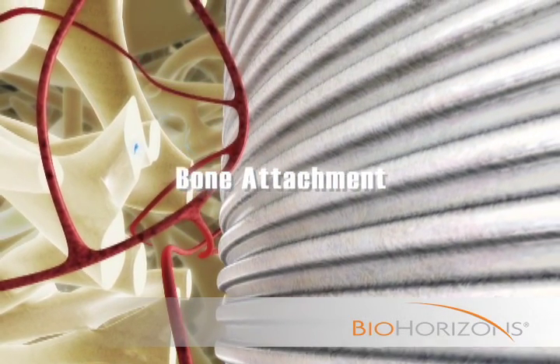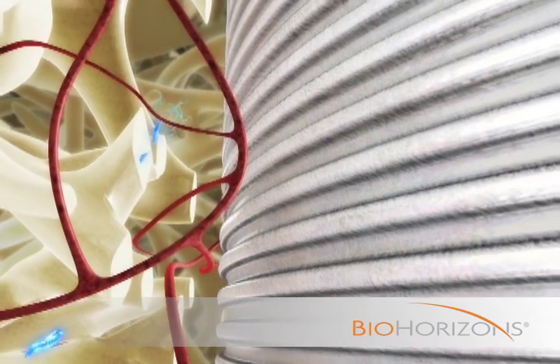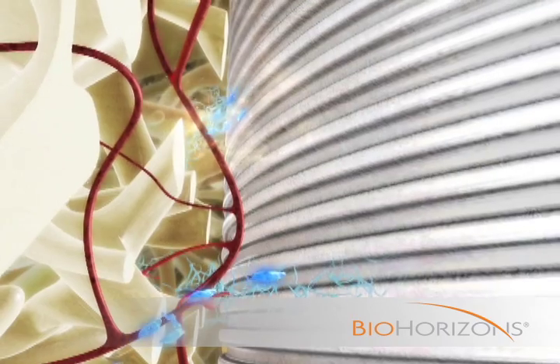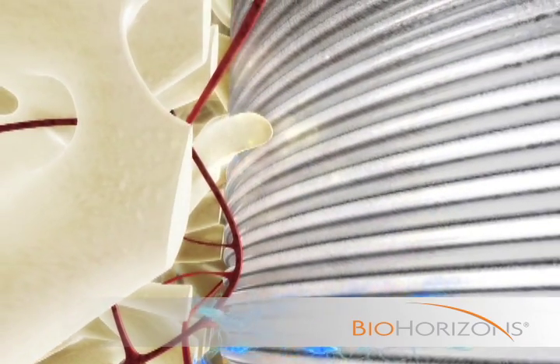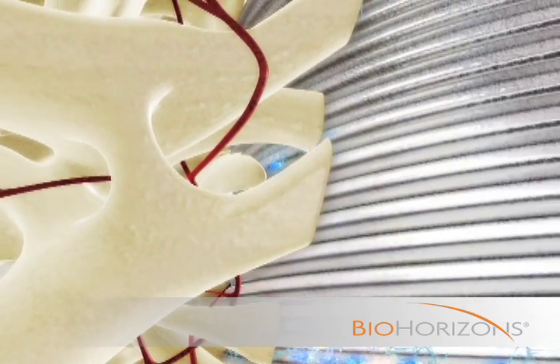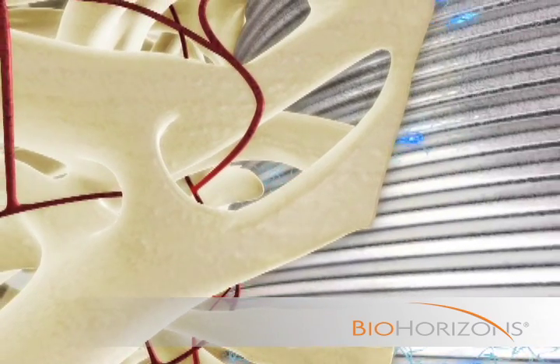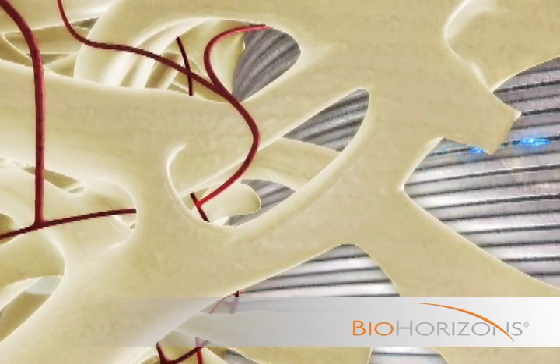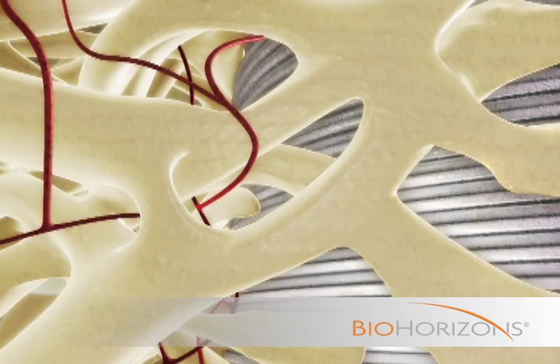Once a stable soft tissue seal is created, osteogenic cells migrate along the implant surface and are directed into the laser lock microchannels where they attach and differentiate. Osteoblasts begin to form a circumferentially oriented bone microstructure with trabecular attachments parallel to the micro grooves. These structures mineralize during normal healing.